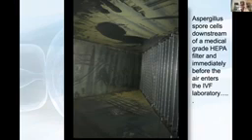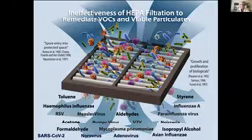So we saw this, and if you notice, an effervescent green coating the ductwork, this is actually, after culture, Aspergillus. Now, Aspergillus can cause illness and infection in staff. It's also cytotoxic. Aspergillus itself is quite large and should be captured by the HEPA filter. But Aspergillus, like any other organic captured by the HEPA filter, has the ability to continue to grow. It needs 2 things, food and water. Food is often the other organics, sometimes the matrix of the filter. Water is simply the humidity in the air. So as these organics continue to grow, if they're able to produce spores, sometimes those spores are small enough to get past the HEPA filter, and therefore you saw the coating of the ductwork.